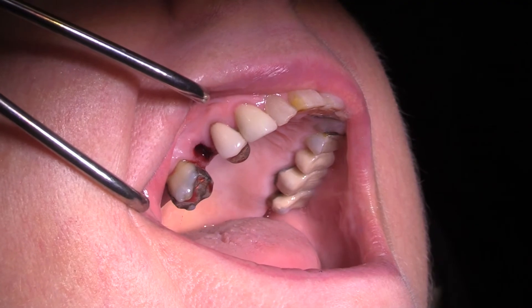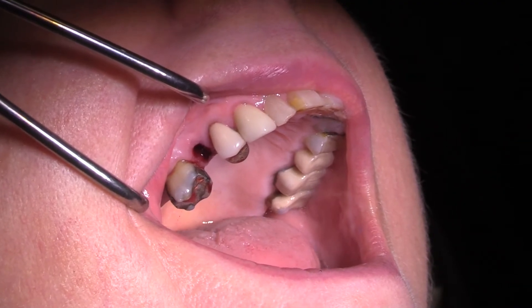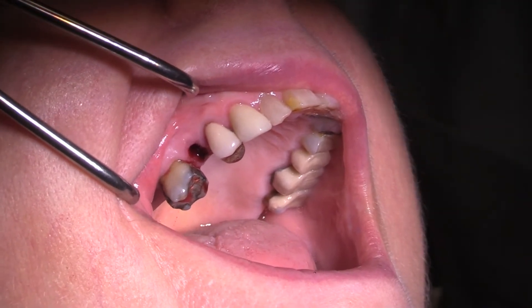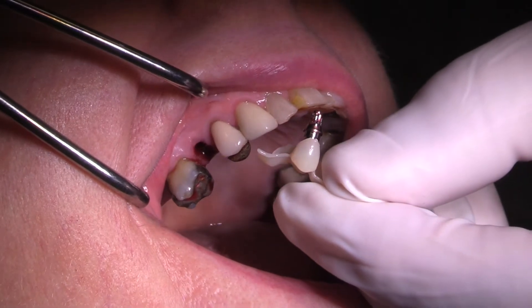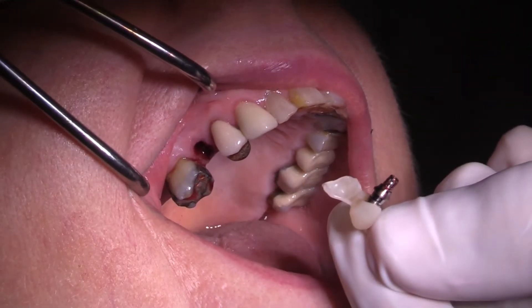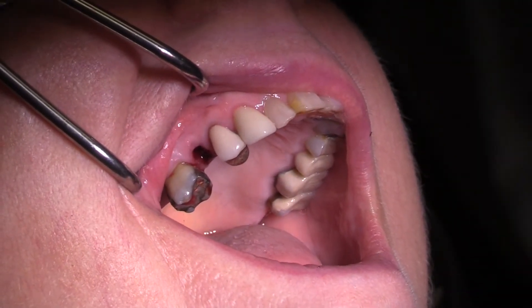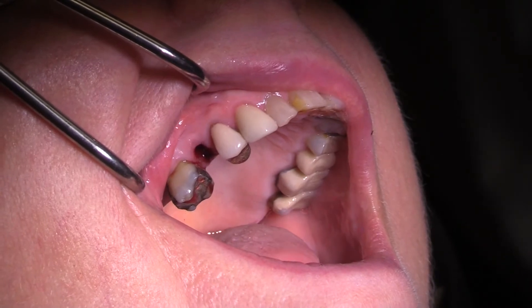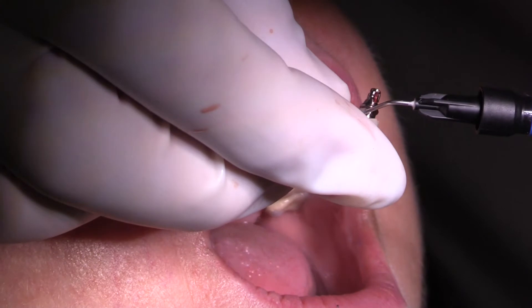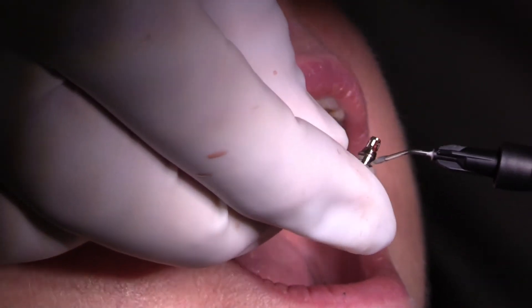The patient is going to have very little pain the next day. This is like putting a bandaid on a cut — the tooth was removed, implant placed, temshell placed. In my mind, this minimizes the inflammation in the area because the whole cut and access to the site is covered over and supported, so the soft tissue is supported. Once the temshell is fabricated, this is also the time when you'd add bone grafting if you wish.